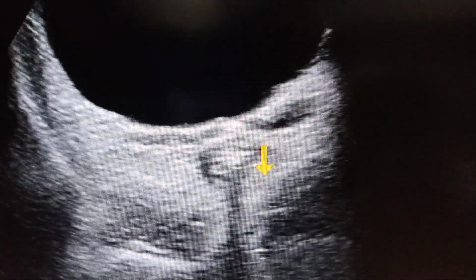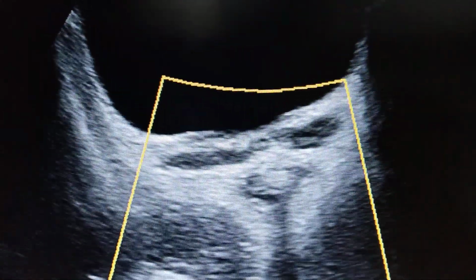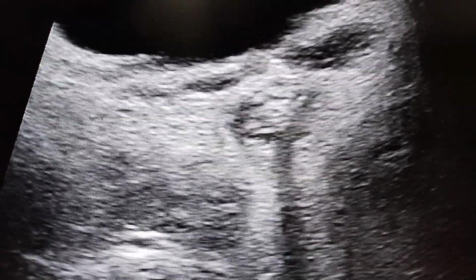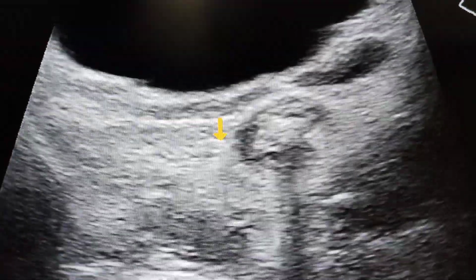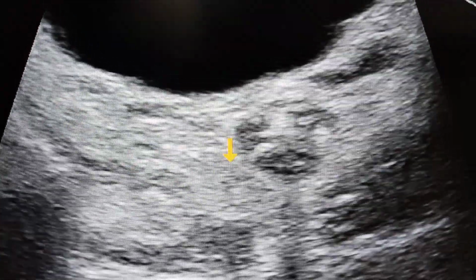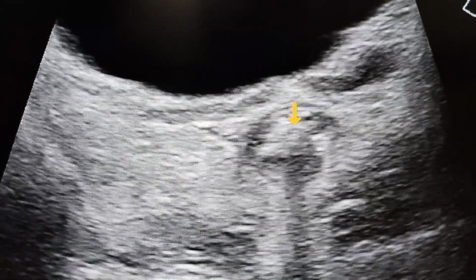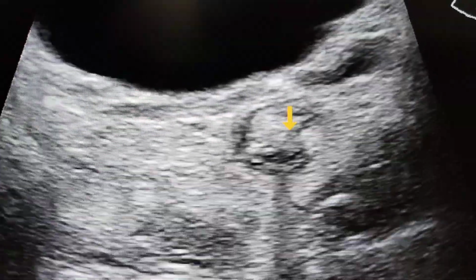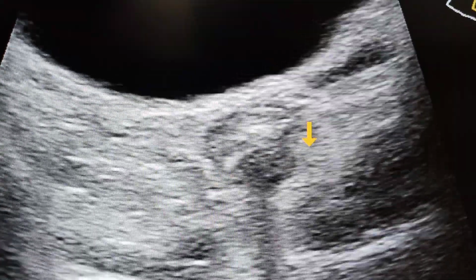This is the rectum, and this one does not seem to be too much involved, as we have seen in the descending, sigmoid, ascending, transverse, and flexures. It seems to be relatively normal looking. We can appreciate the walls. So it means that there is a sparing of the rectum while the whole large gut is involved.